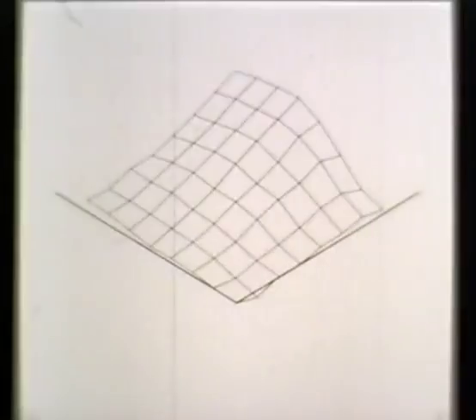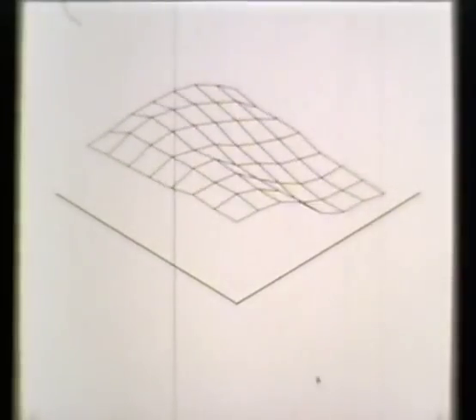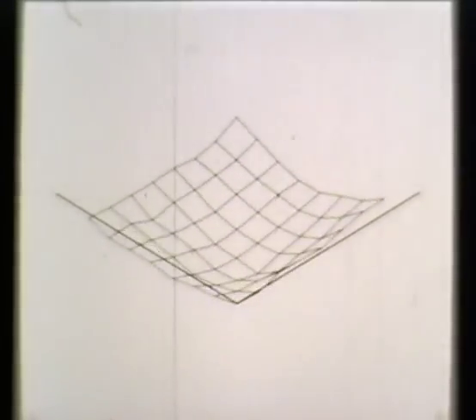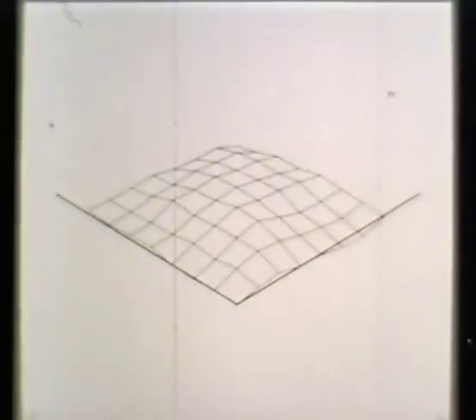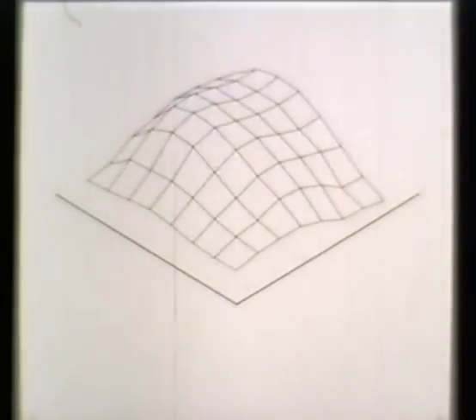The 3.5 by 3.5 millimeter array shows coherent activity, which is maximal toward the center of the array and which diminishes towards the margins of the array. The display shows the location and size of an active focus, which occupies a limited region of the lateral wall of the bulb.